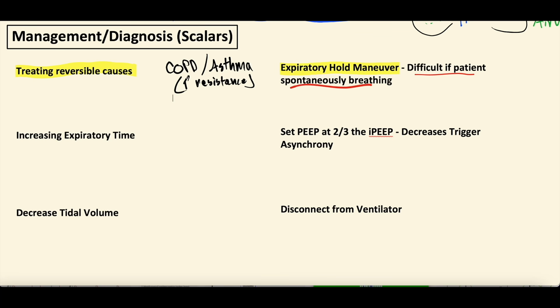In fact, with the diagnosis of COPD, prolonged expiratory phase is part of that diagnosis when they're not on a ventilator. You'll sit bedside and you'll have this inspiration and then this really long expiration. So that prolongation of the expiratory phase can really affect that.